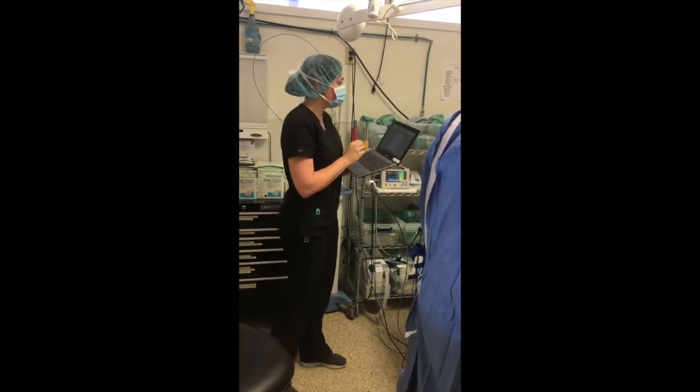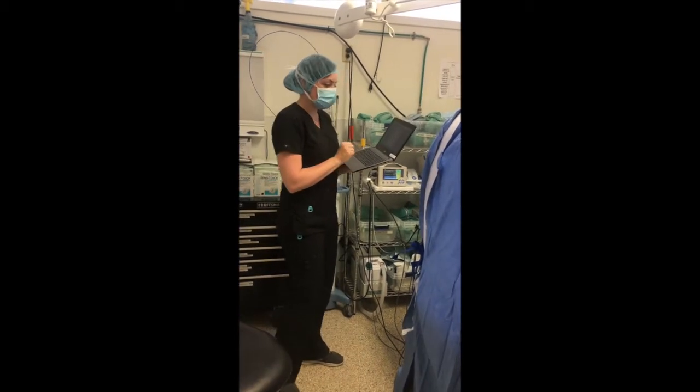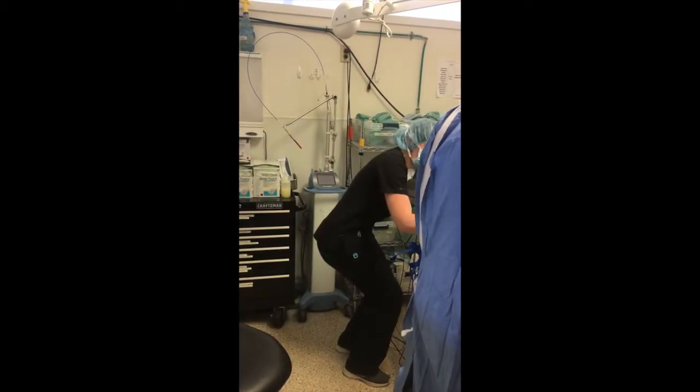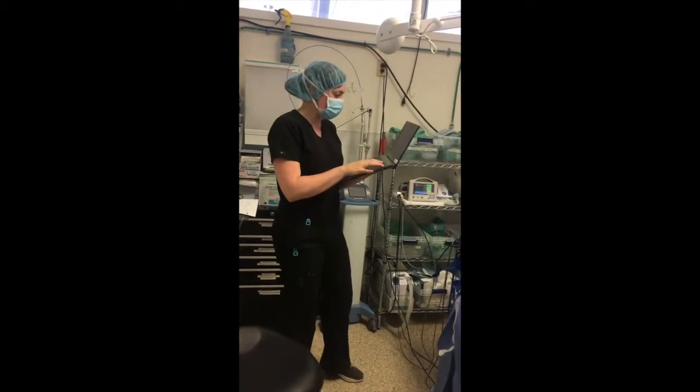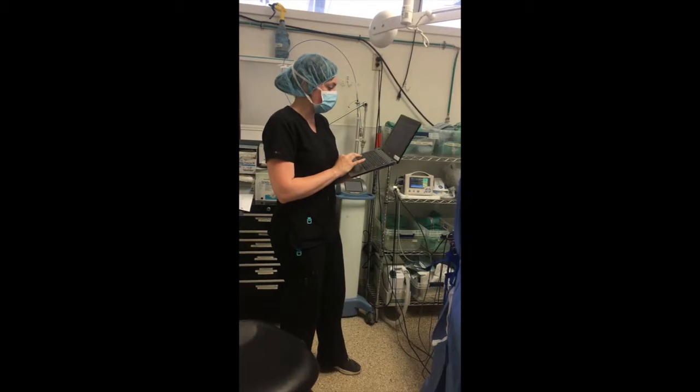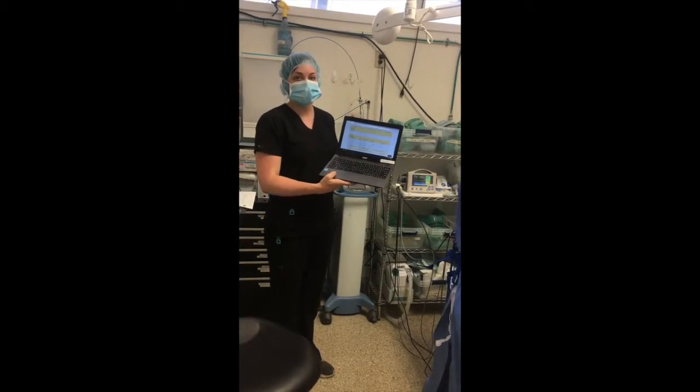Her vent rate for her ventilator is at 8 breaths per minute. And then her mucous membranes, we'll take a peek at her gums. They are pink. I'm going to write down that they are pink. All right, I'm going to click save. And then I've just taken some vital readings for our little kitty in her spay.